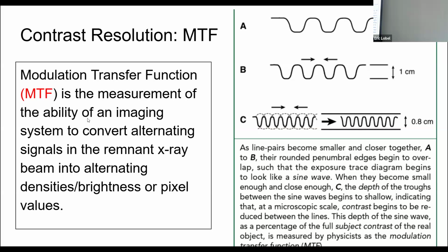That would be like exploratory surgery, where we cut you open, take something out, and be able to look at it. X-rays are getting good, but they're not that good. A 0.6, 0.7, 0.8, that's much better. So a 1 really can't happen. A 0 can. That's just basically a malfunction, and you get a black image, and you get nothing. So that can certainly happen.